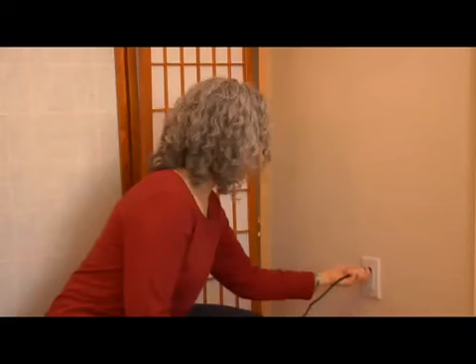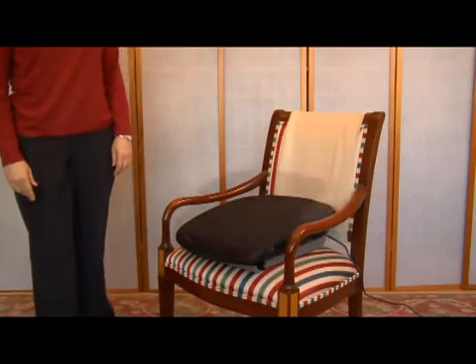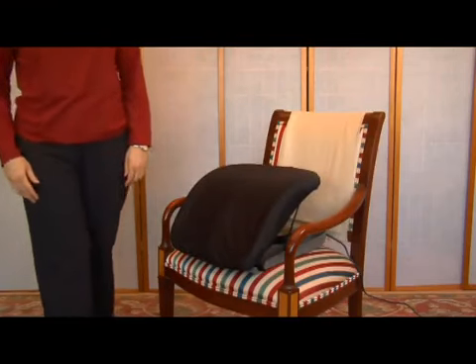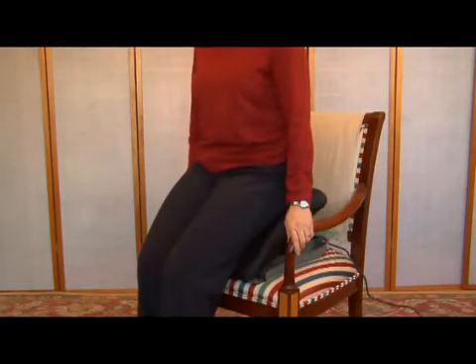Place the PowerSeat on a stable armchair or sofa. The back of the cushion should not be touching the back of the chair, or it will interfere with its ability to go up and down. Next, move so that the backs of your legs touch the PowerSeat. Push the PowerLever down and place both hands firmly on the armrests of your chair as the PowerSeat goes down.